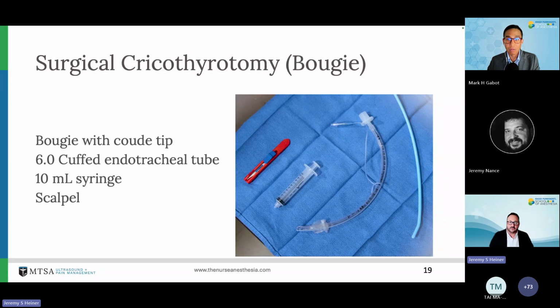The good news is if you've used a transtracheal jet ventilator, you can regulate the pressure. There is a pressure gauge. Typically, if you're going to be ventilating with that, you'll want to keep the pressures around 20 to 25 PSI, and really just look at the patient's chest as you do a 1 second burst with the jet ventilator. Look for chest rise, and as you get that chest rise, let go of that triggering mechanism.